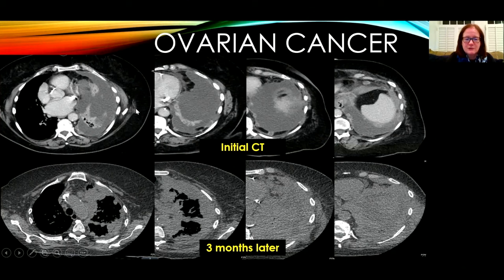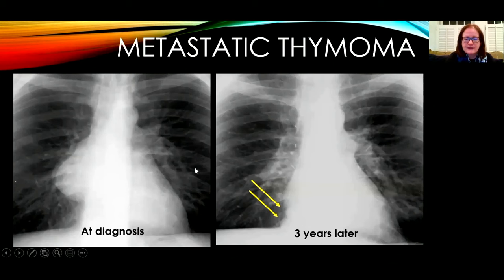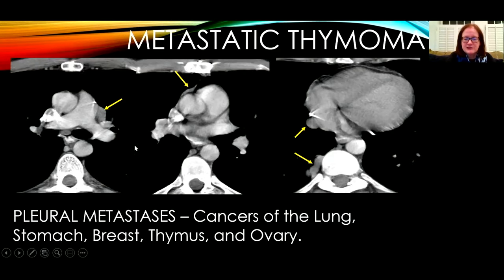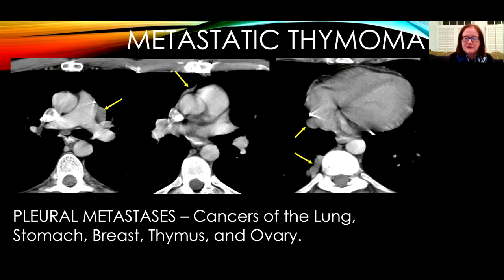The initial CT with contrast shows nodular implants along the left pleura with a large left pleural effusion. Three months later on non-contrast CT, there is progression of pleural thickening extending over the mediastinal aspect and into the fissures. A patient with metastatic thymoma shows the original thymic lesion, and a chest radiograph three years later shows recurrence with extraparenchymal or pleural implants. CT with contrast shows pleural implants bilaterally causing extraparenchymal masses making obtuse angles with the chest wall and involving the pleural interface. Pleural metastases most commonly result from cancers of the lung, stomach, breast, and thymus.